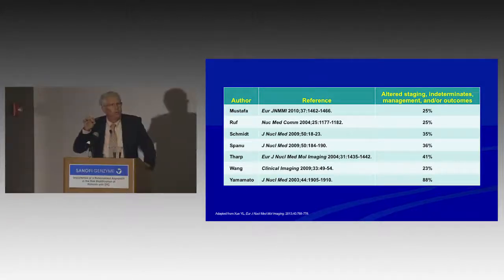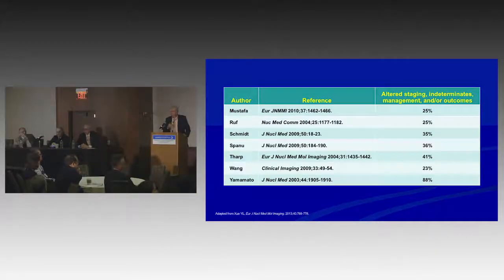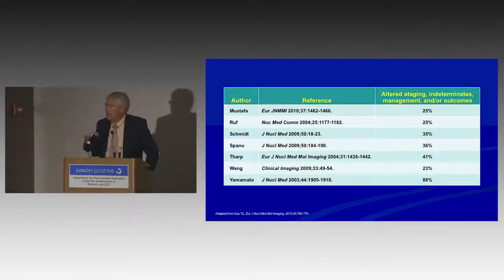So why are there so many facilities that will not perform pre-therapy staging scans, and they're good facilities, and why are there so many facilities that say there's value from pre-therapy staging scans? And I think one of the most important single things that's not talked about is technique.